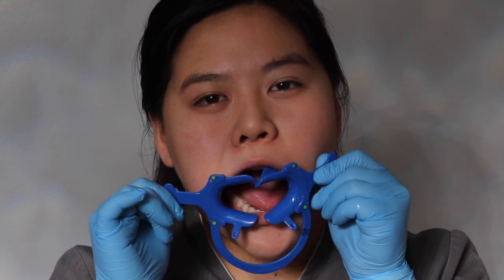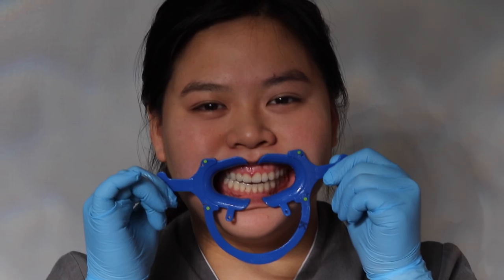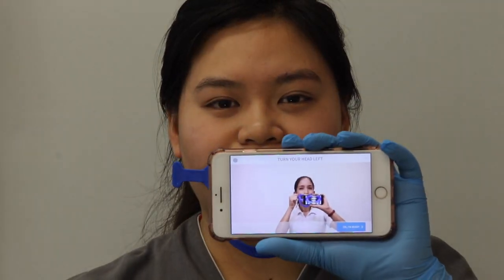Insert one side of the lip retractor first, then the other side. Once you have done this, start your scan.